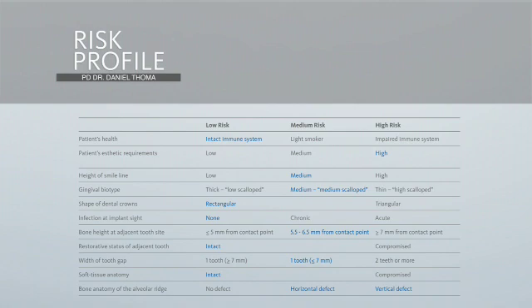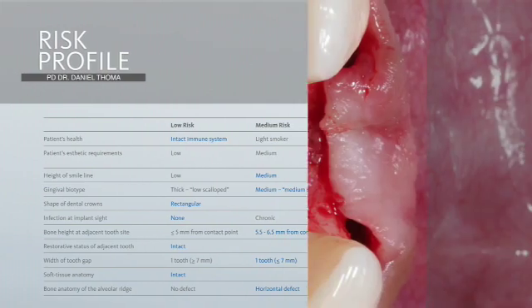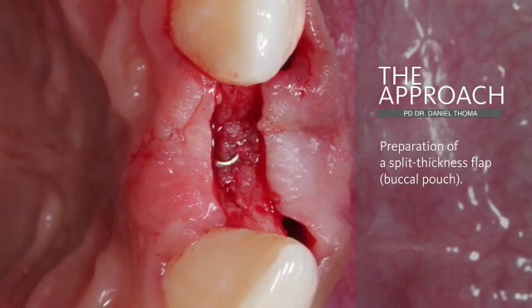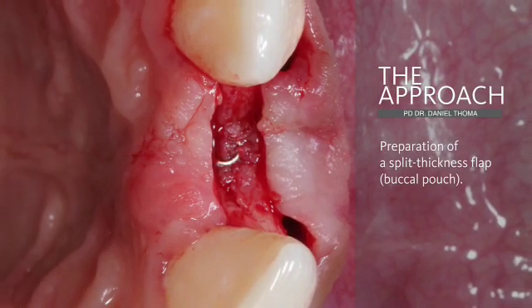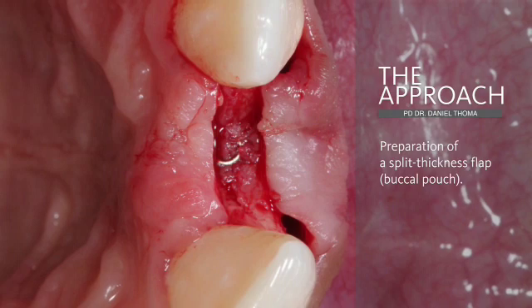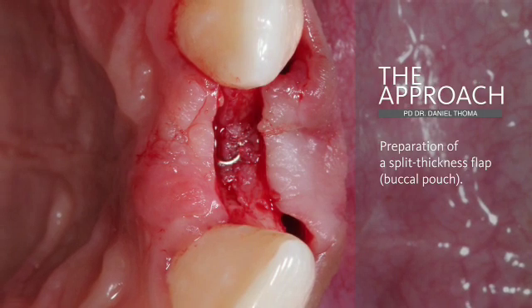The soft tissue anatomy is currently intact but we do have a horizontal and vertical defect. As a first step to perform the soft tissue grafting procedure, a split-thickness flap is prepared crestally on top of the implant and also on the buccal side.